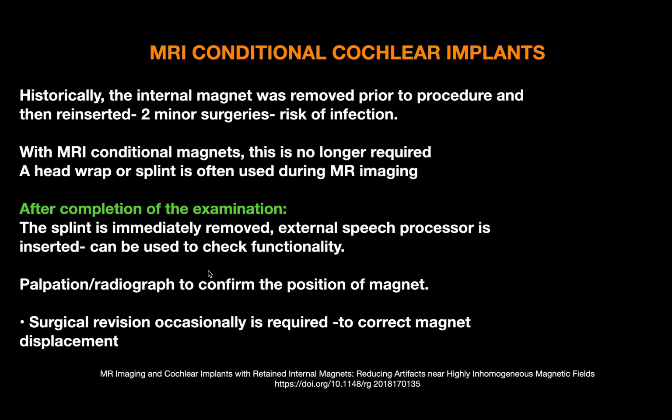After the completion of the examination, we should always take one radiograph or do palpation to confirm the position of the magnet, and surgical revision is occasionally required to correct the magnet displacement if it is there. So this is the cochlear implant.